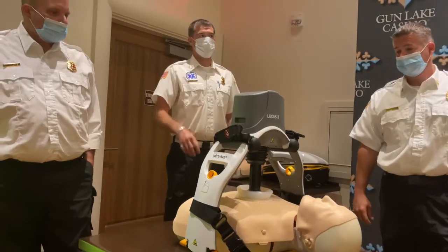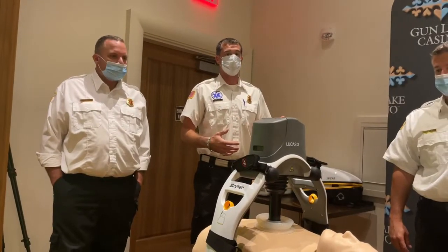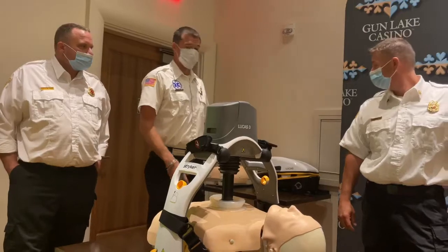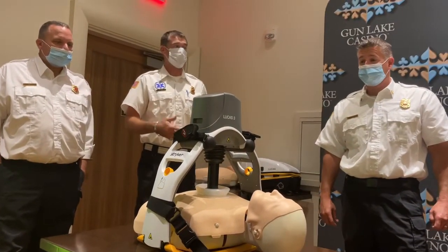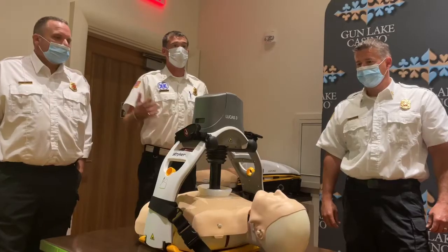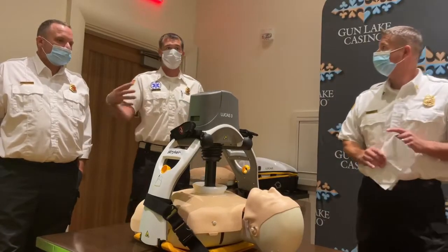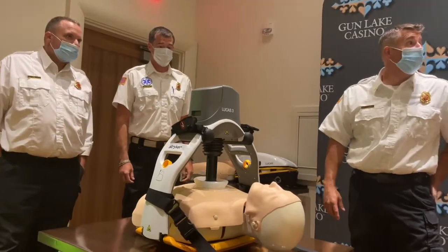Everything is universal between the units that have been donated to Wayland, even though they might have changed versions — all of the battery packs are the same. So we can actually plug it right into a wall if you're going to be there for a long time, or if it's a longer transport, we can get a hold of neighboring departments that have the equipment and interchange everything in the event that you need to. It's really an amazing piece of equipment.